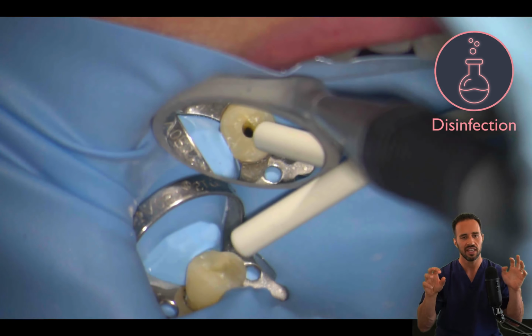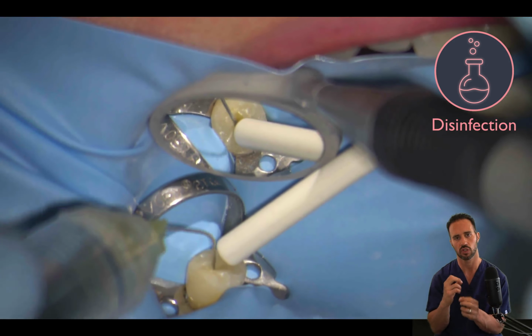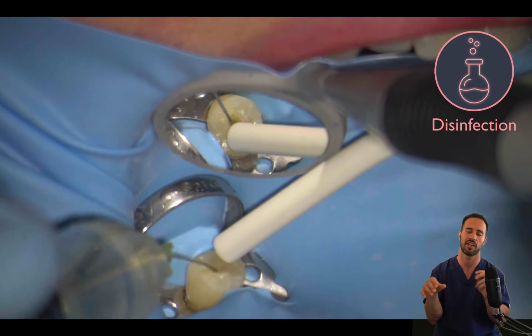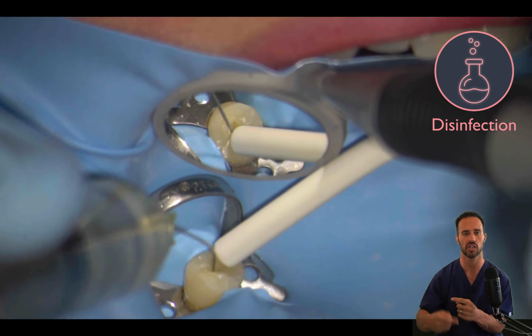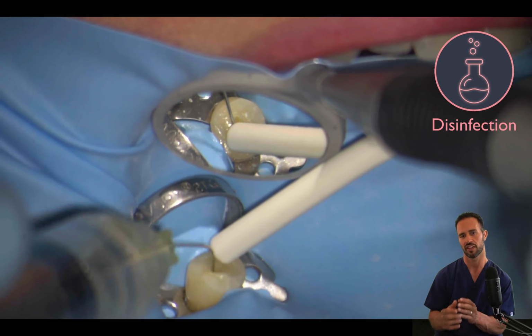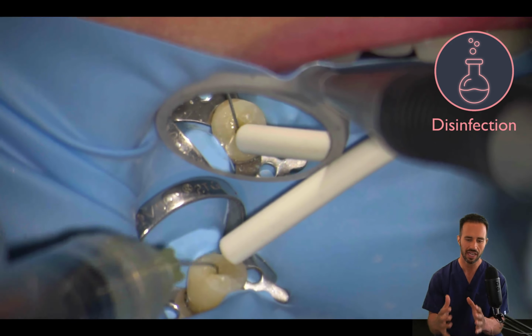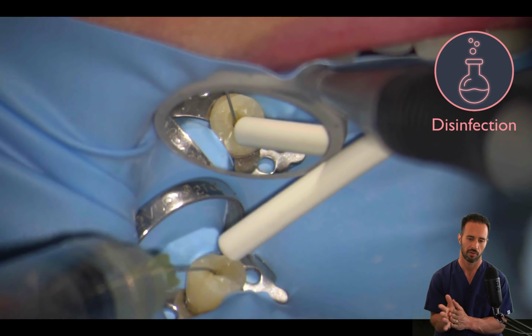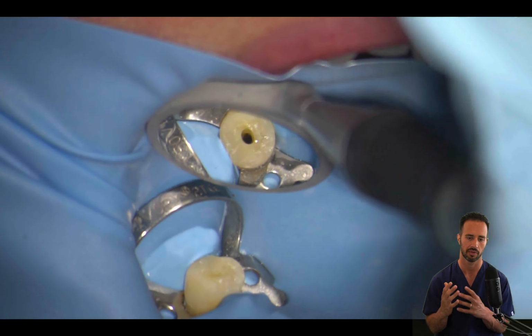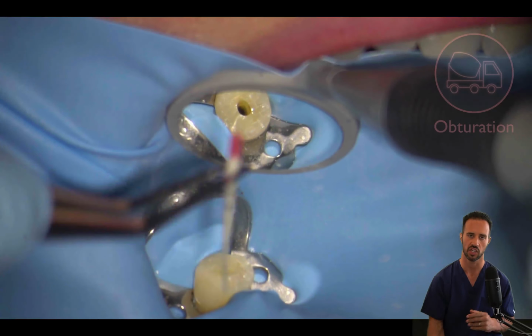Okay, the EDTA is going to remove the smear layer within the tooth. And then the last flush with sodium hypochlorite is going to allow that cleaning action a little deeper into the tubules that have now become open from the administration of the EDTA. All right, so this is our final flush with our sodium hypochlorite that's going to complete the disinfection stage of our treatment. And you can see we have a nice, neat area that we're working with, okay? The assistant is holding the surgical suction tip right up against there, so there's no leakage at all of the sodium hypochlorite. And now we're going to progress to the obturation phase of the treatment.